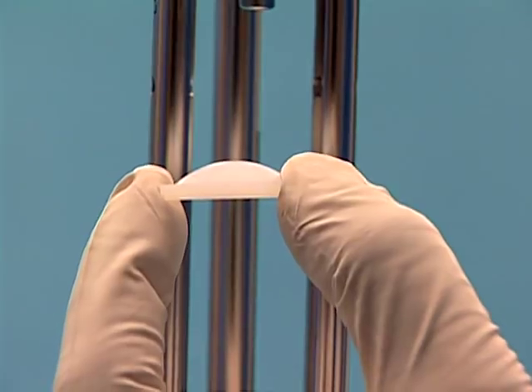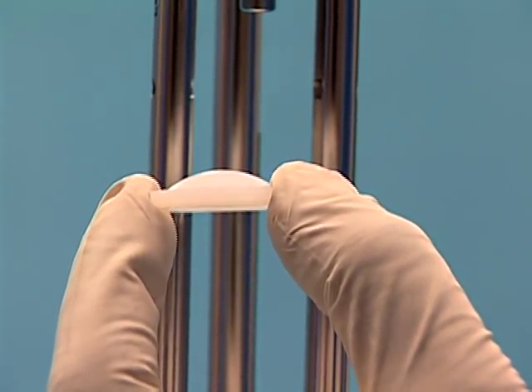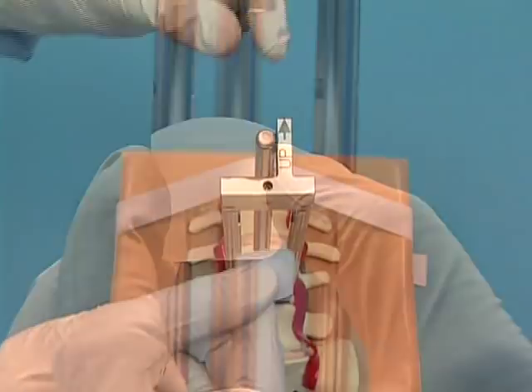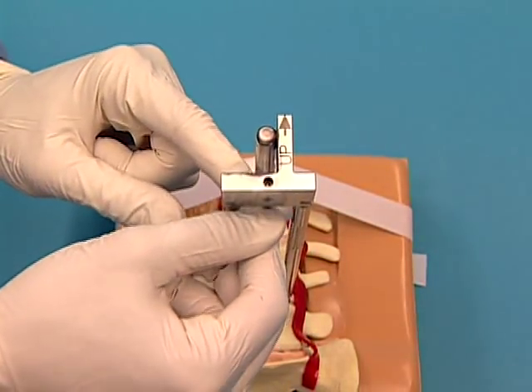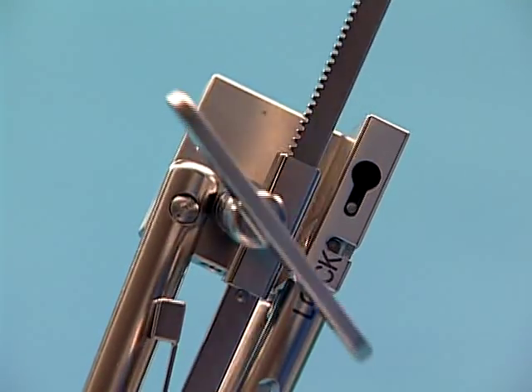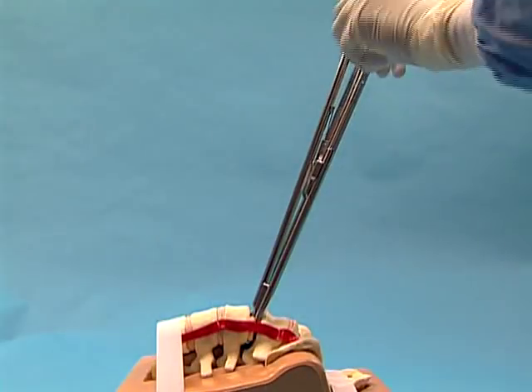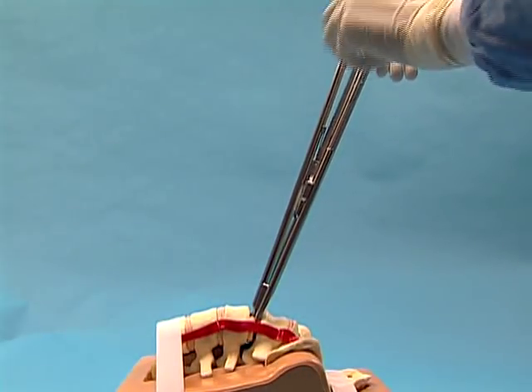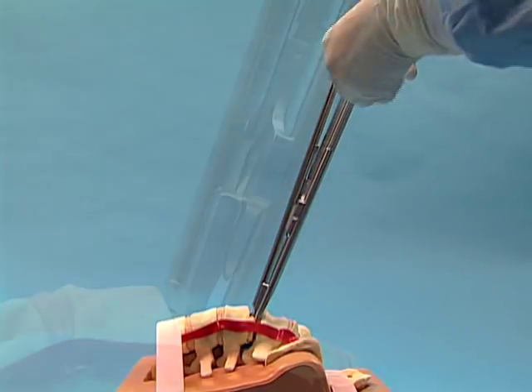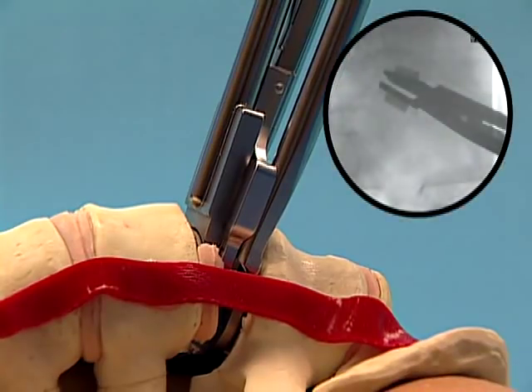Insert the polyethylene inlay into the grooves in the inferior arms of the inserter with the dome up. Let the polyethylene inlay fall to the first ball detent. Assemble the distractor to the inserter. Under fluoroscopic control, use the thumb screw to fully advance the distractor. Verify that the posterior edge of the end plates have separated from each other to ensure adequate clearance of the polyethylene inlay.